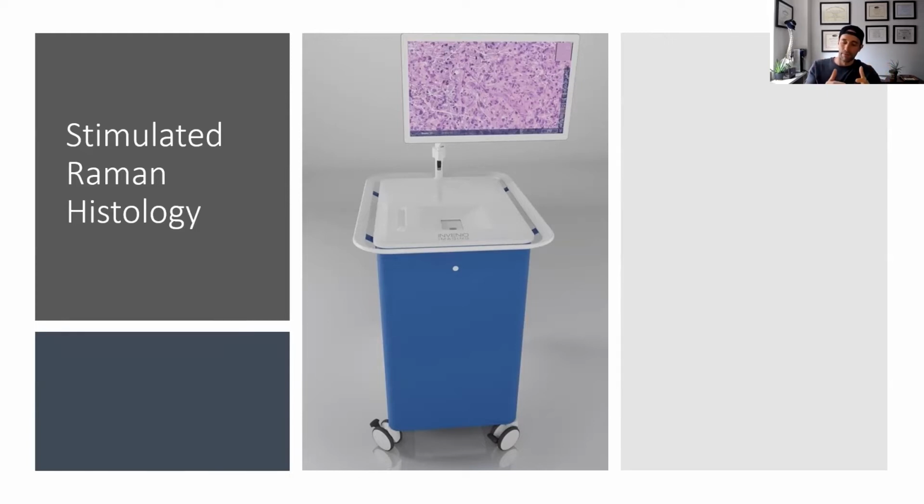You need everything. And I personally think you need this because as you get to that margin, if you're not sure if it's brain or tumor, you put it in this machine. And what this machine does is it uses a laser, a Raman spectroscopy, and it's able to create a virtual H&E image. If anyone's ever seen an H&E image, it looks just like this, all right? This is created in 2 minutes in the operating room with you, all right?